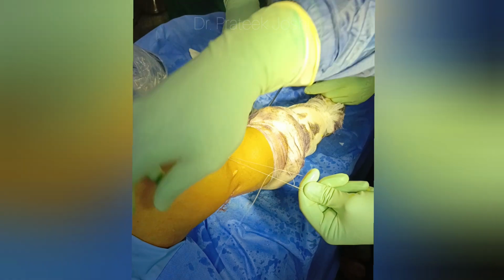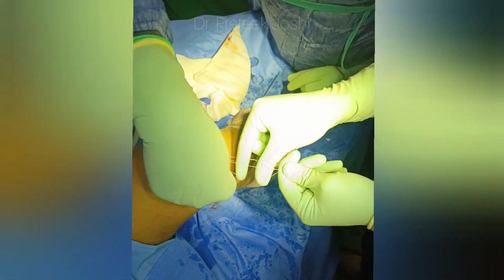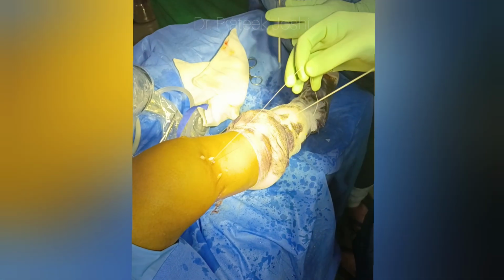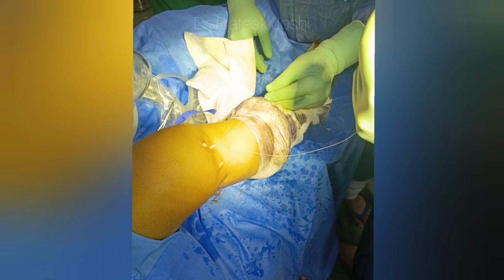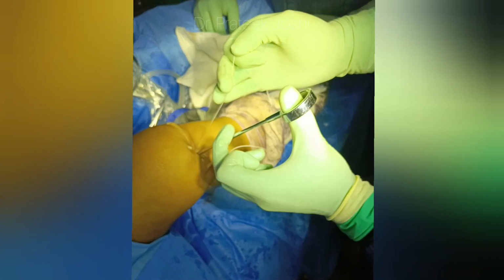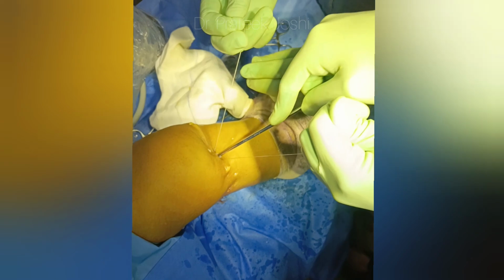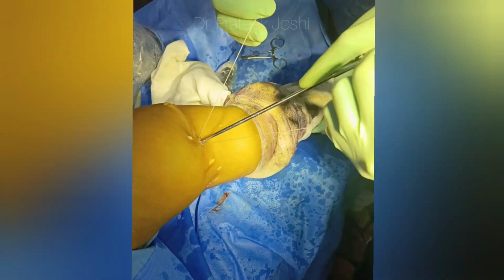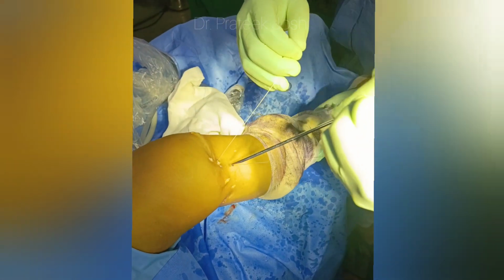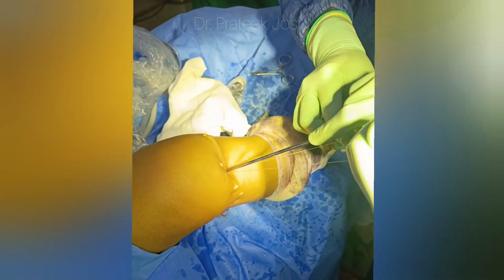Once we have passed all our threads outside the knee joint, then we are going to start the knot tying process. So as you can see, I am using SMC knot to tie our sutures. I am using knot pusher to sit my knots as deep as possible, and we should be very careful not to pull too much or not to push too much because these are very small diameter threads. Last thing you want is that the thread gets cut, and then you will have to repeat all the steps all over again.